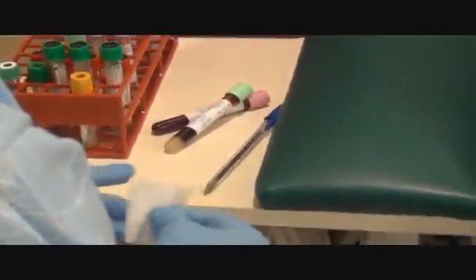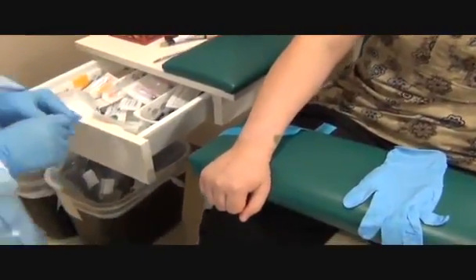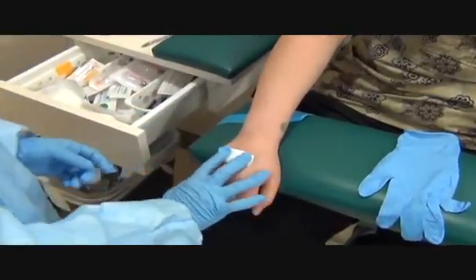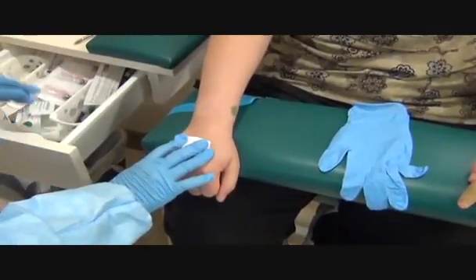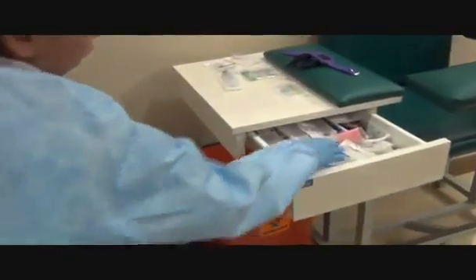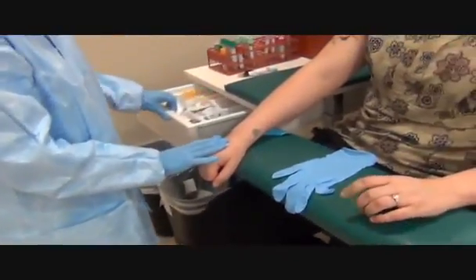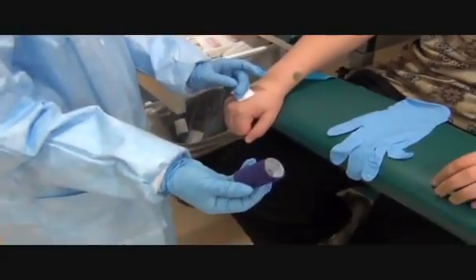Are you on any blood thinners? No. Okay, take a look. Because the patient's not on any blood thinners, I would normally use a bandage. But because we drew the hand and the hand is used more, you would probably want to use CoFlex. That way you bandage up the patient better in case they do lift anything heavy. This is what CoFlex looks like — it comes in a wrap and it sticks to itself.